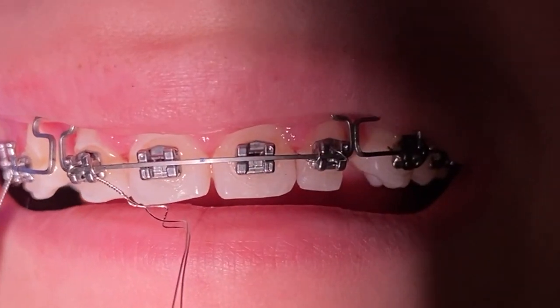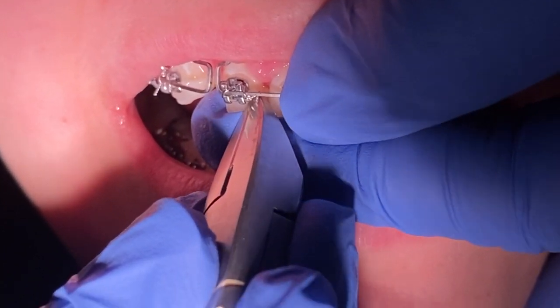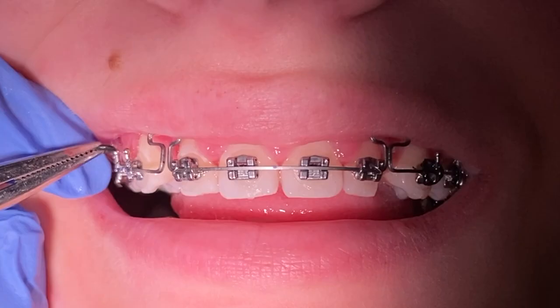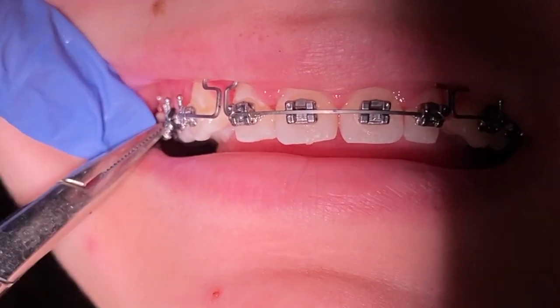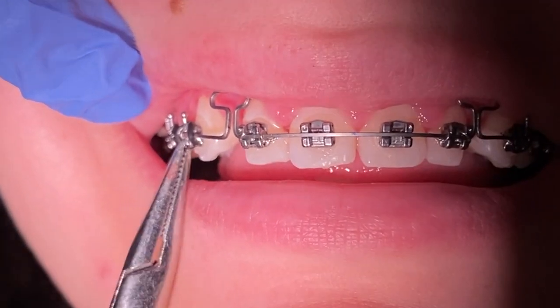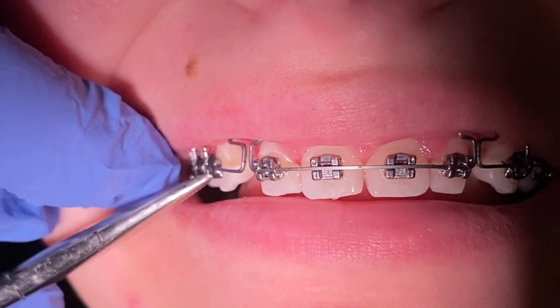Now remember what I said — this wire has a lot of force. What it's going to do is activate. The little loops you see on top of the wire, the hooks — what we call Snoopy hooks — that is going to help close the spaces up here. As you can see, the wire was pulled back on the back, creating an opening that's activating. Over time the patient's spaces are going to start closing up, the wire will close up as well, and at the next visit you'll see those closed spaces. Stay tuned toward the end of the video — we're going to show you the progress pictures from the initial time of treatment until now. This patient has made huge progress, and it just goes to show you: stay committed for the results you can get.